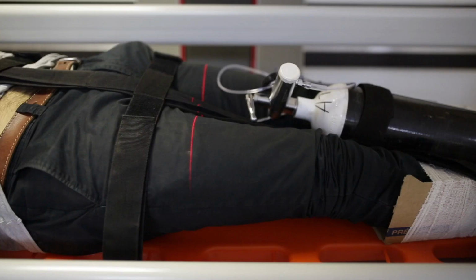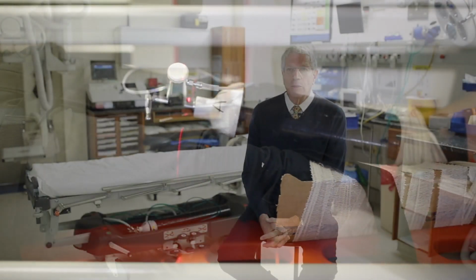When the patient comes in, the very first piece of equipment that they ever meet in this hospital is the Lodox machine. And they undergo an immediate Lodox on the ambulance equipment, with their clothes on. It doesn't make any difference at all. From the time the ambulance reaches this hospital to the time they're on the resuscitation trolley is about 2 minutes.